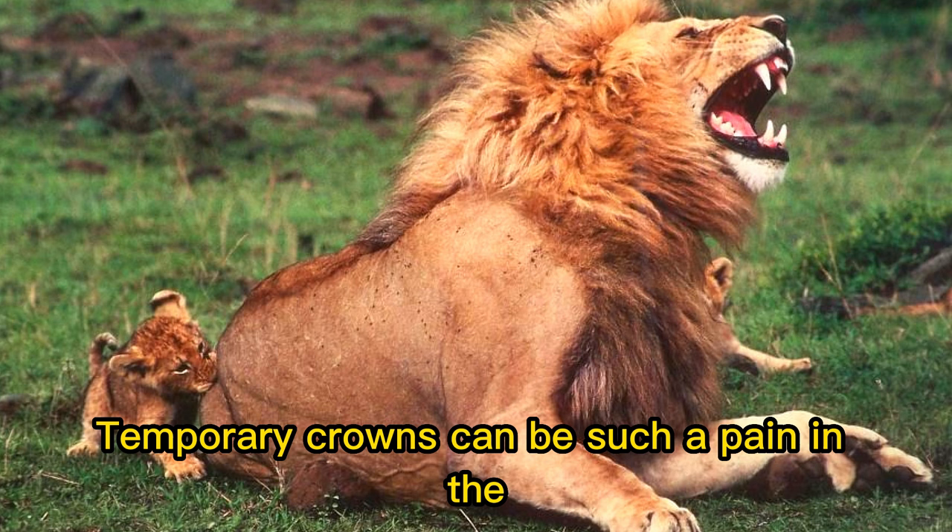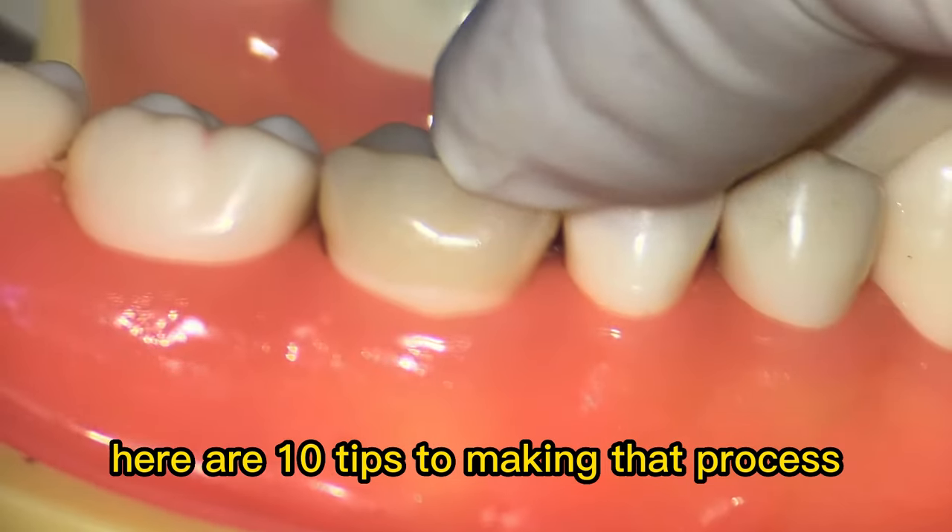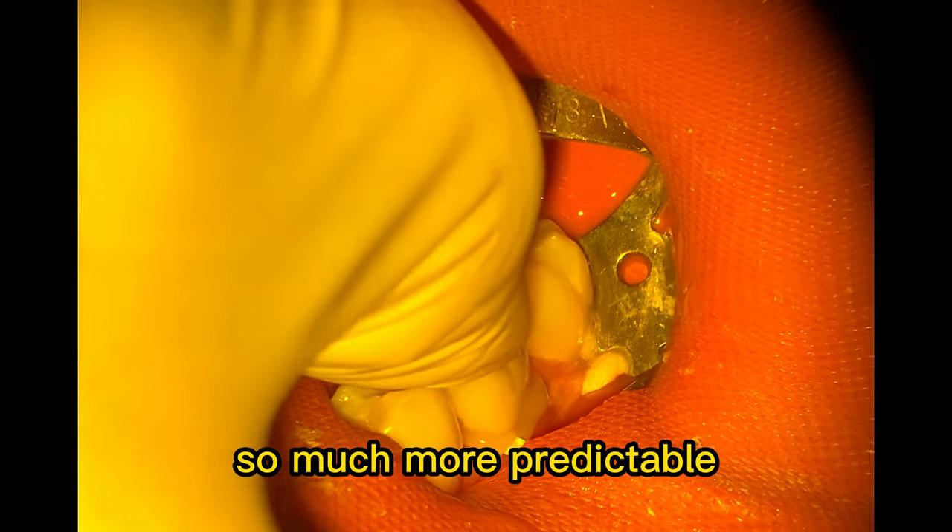Temporary crowns can be such a pain to make sometimes. Here are 10 tips to making that process so much more predictable.